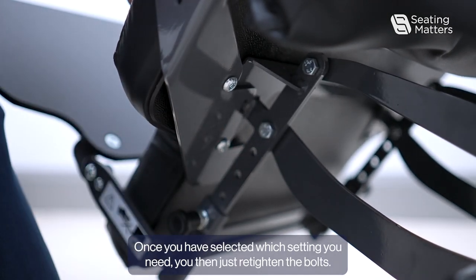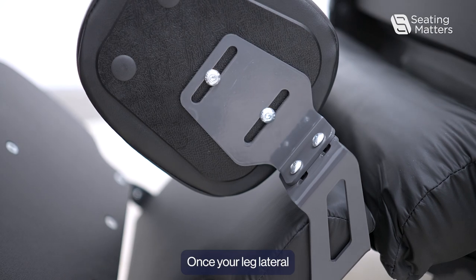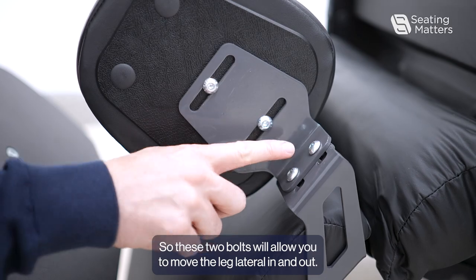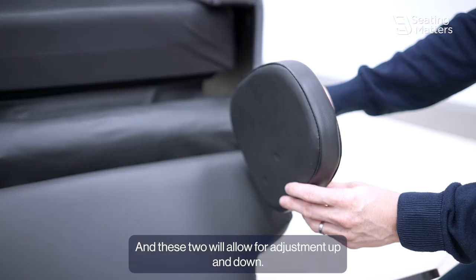Once you have selected which setting you need, re-tighten the bolts. Once your leg lateral is securely fitted, you can further adjust it by loosening these bolts. These two bolts allow you to move the leg lateral in and out, and these two allow for adjustment up and down.